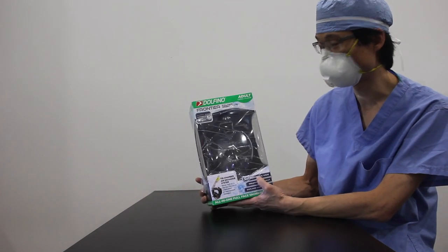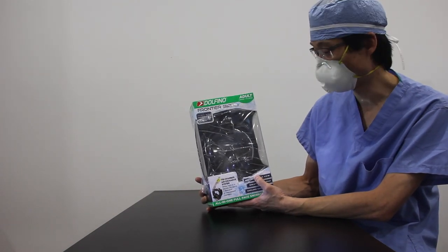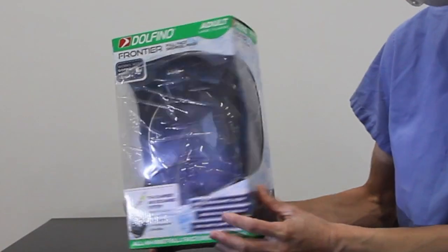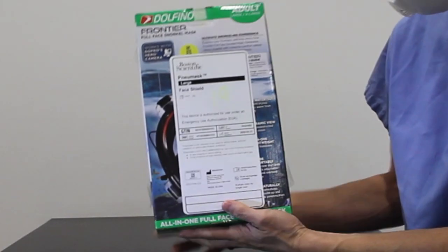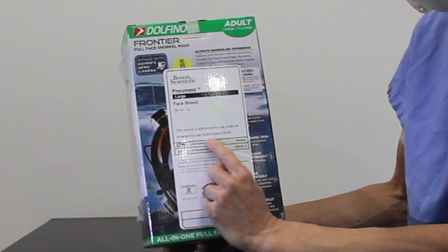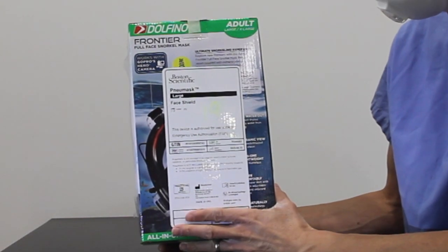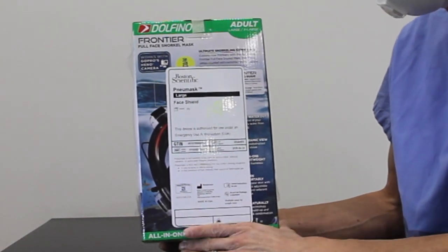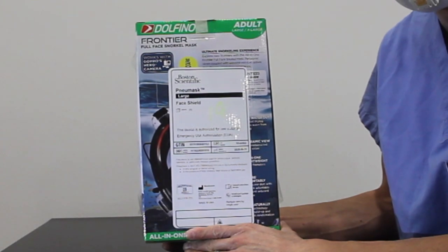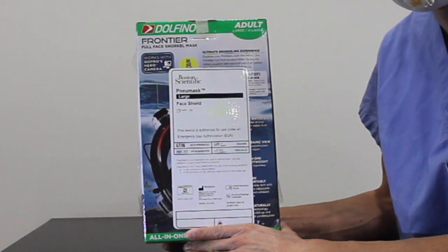As you can see, it looks like the normal Frontier Dolfino mask from Walmart. It's been nicely packed but it's got this nice emergency use authorization sticker on it from Boston Scientific. This is one of the first 1500 masks ever made for this purpose.